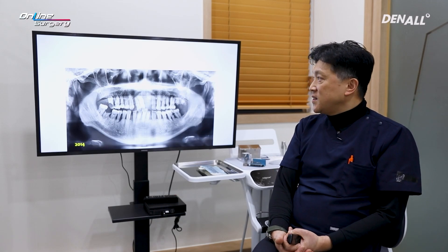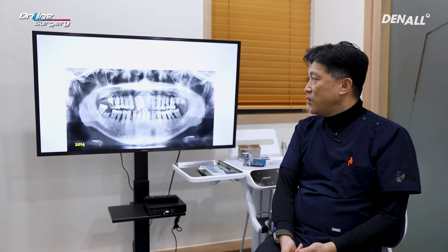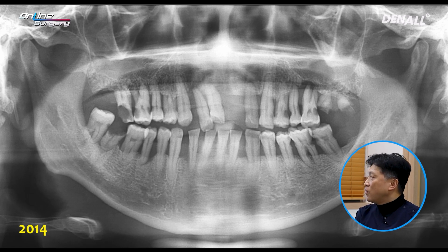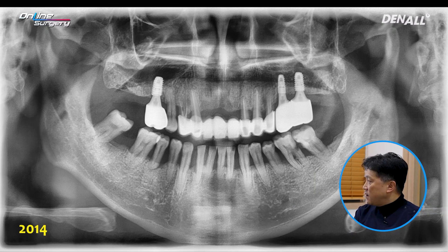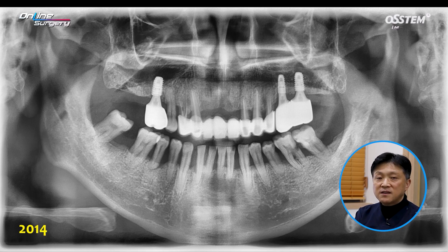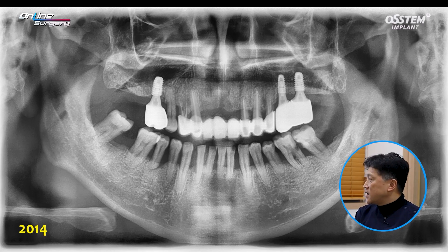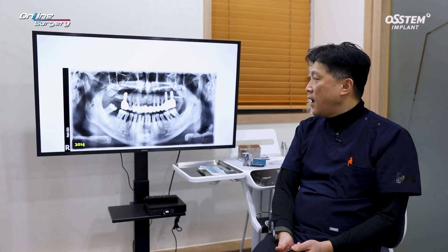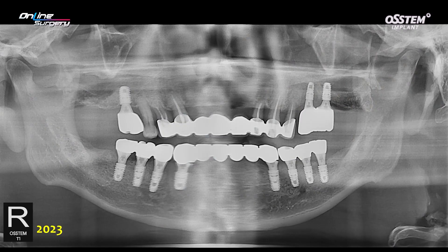Let me show you the patient first. The patient has a bit of history. The patient came to me in 2014 with this kind of oral condition. There were very few teeth to save. Throughout 2014, the patient wanted treatment in the upper. With time, the patient felt the necessity to receive treatment in the lower, so one guide was used to provide a full mouth restoration.